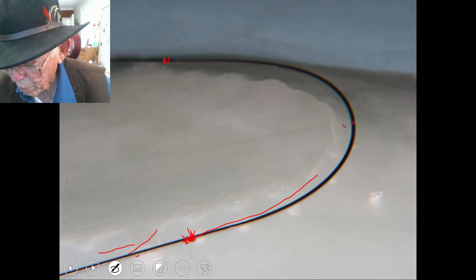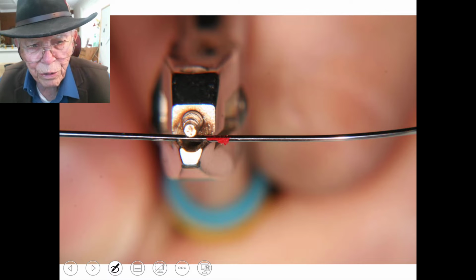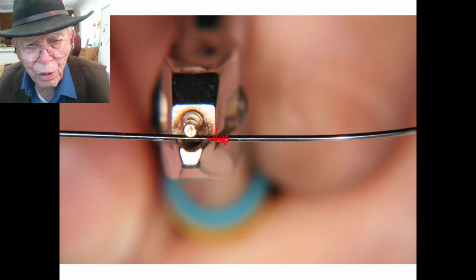Now I'm going to erase that, and we'll go. Now I'll put the plier at a certain distance from this mark where I realize I want this loop to come out right along in here.